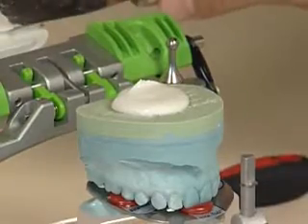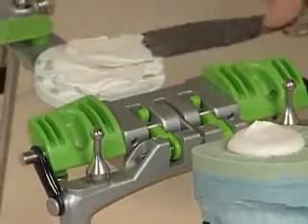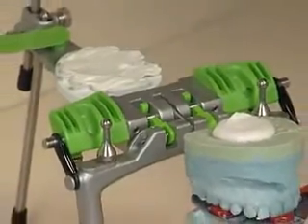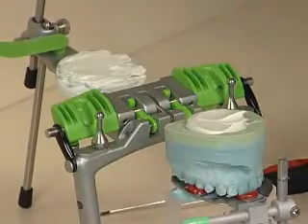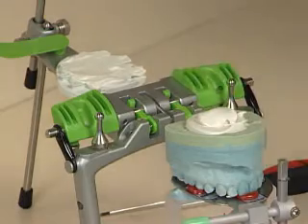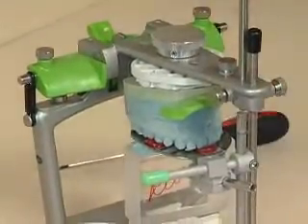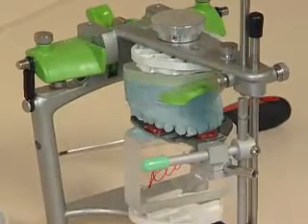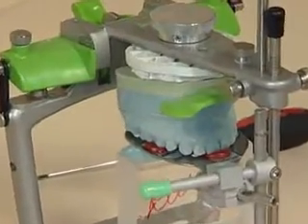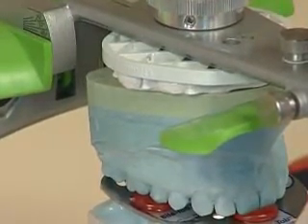Now work it in. We work it when we add to that mounting plate. We work it in to make sure we get it into the undercuts on the mounting plate, so we have good retention. And we'll add just a little bit more, and then just close it down. You just want to attach the model with a little bit of mounting stone, because later we'll fill it all in and make it nice and smooth and pretty. So for now, this is all we're going to do.